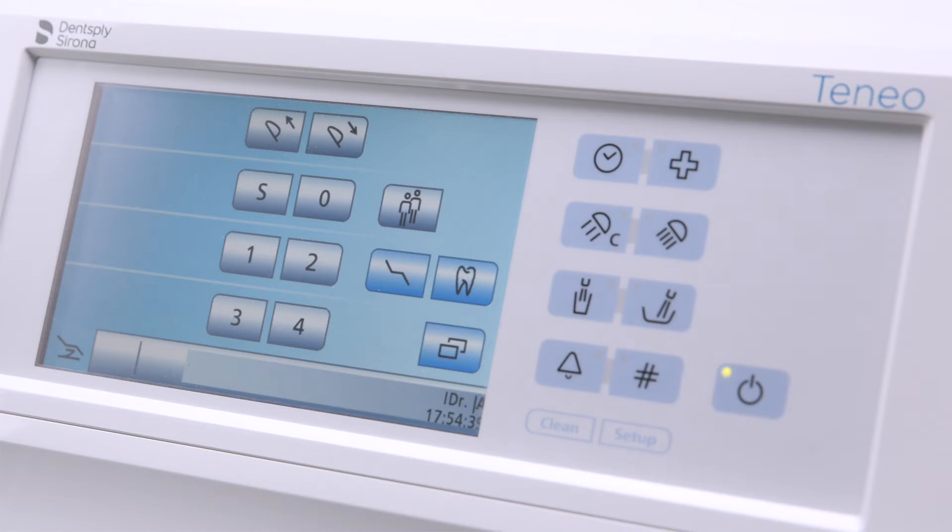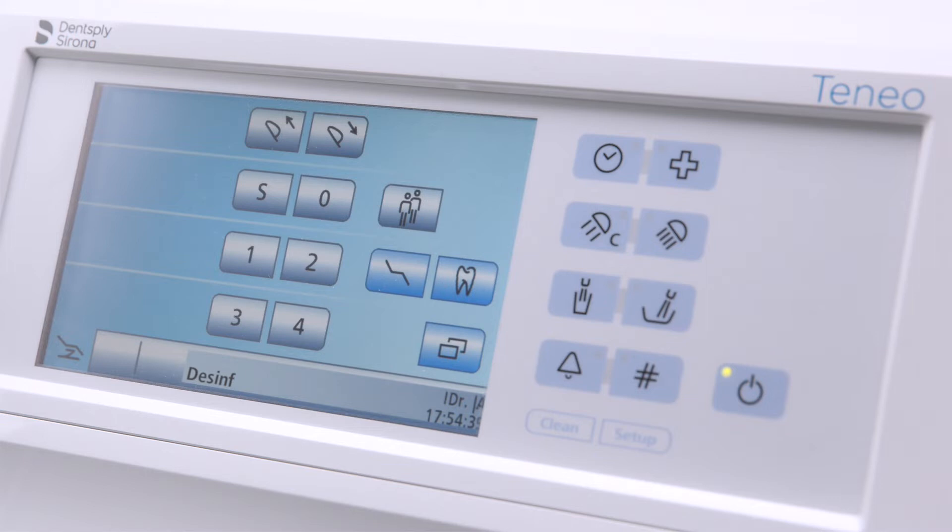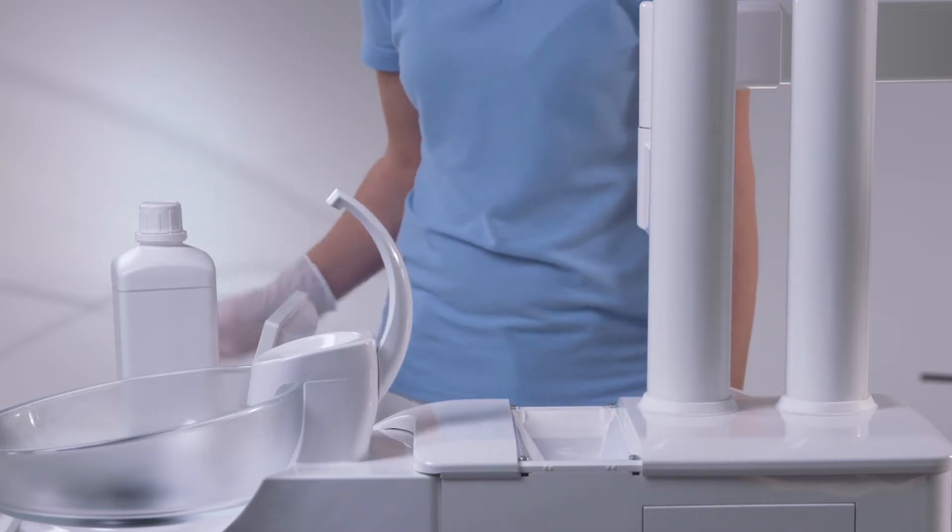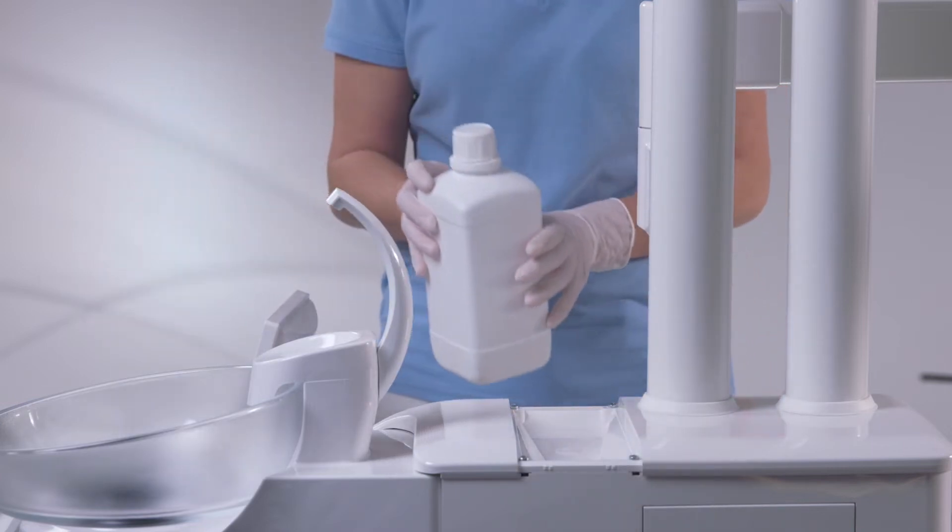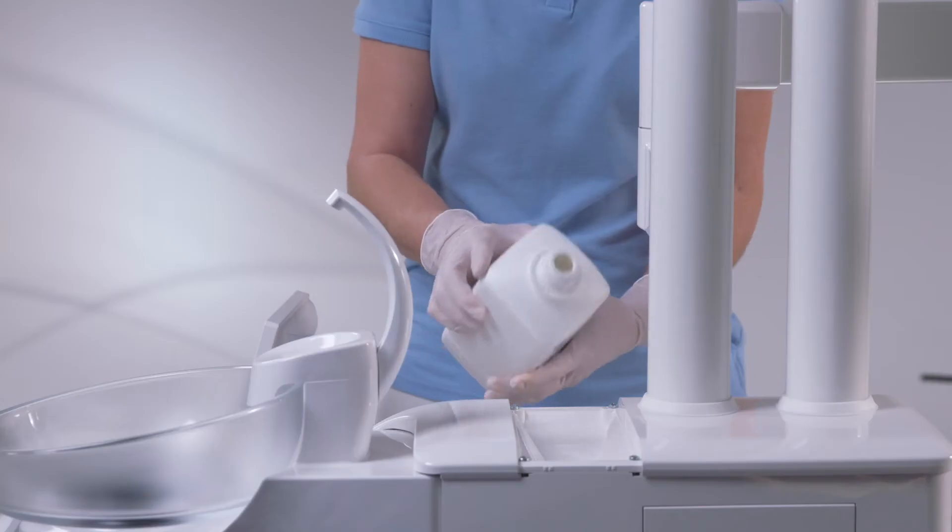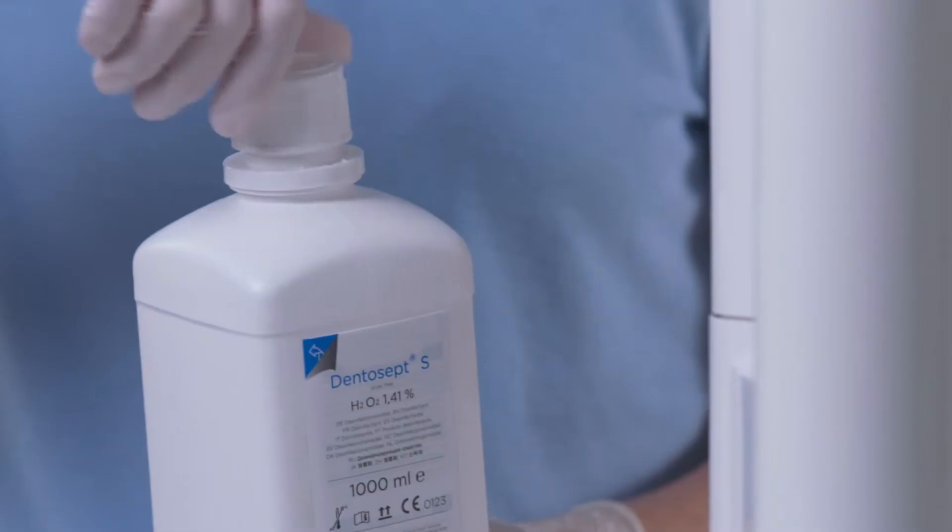If the level of disinfectant for the water lines is low, DES-INF is shown in the status line of the EasyTouch. Open the cover of the disinfectant tank and fill with Dentosept-S. The disinfectant tank has a capacity of approximately 1.3 liters. It is full when the middle of the filling tunnel filter is visible.